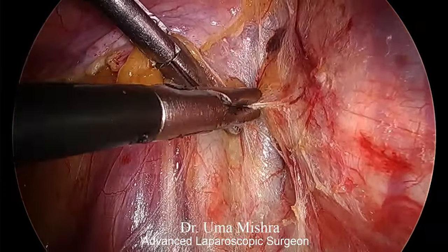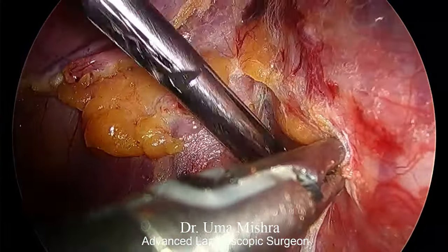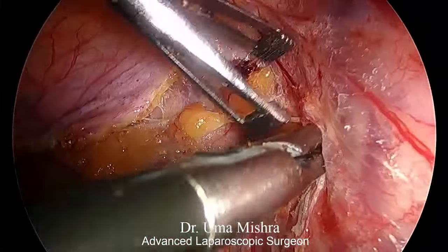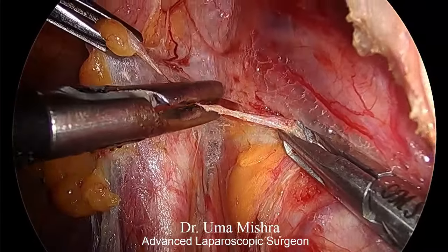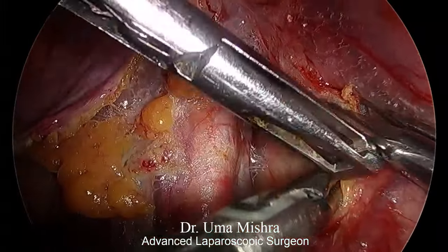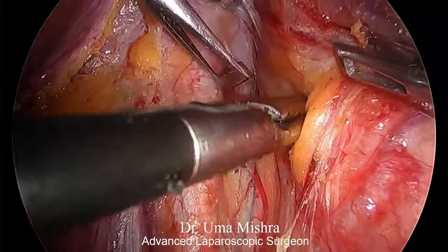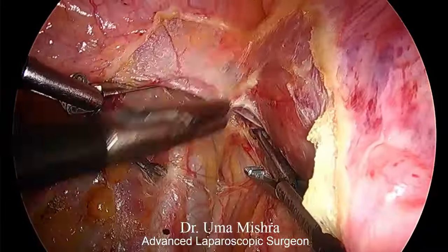Major vessels are very close to my operative field, so we have to be careful while dissecting. We have to dissect always parallel to these vital structures such as vessel, ureter, internal iliac artery. So the role of assistant is very important in such cases in providing traction, just keeping all these vital structures in the mind. Keep on dissecting parallel and just take small chunks at a time. Always see what you cut and cut what you see.